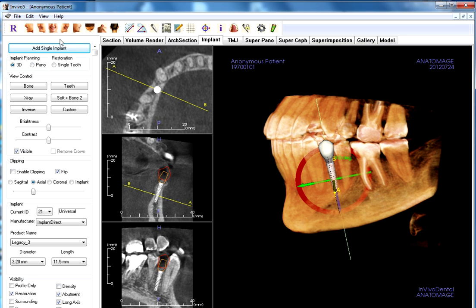That is the InVivo 5 software, and from here, along with the scan of the model, this will be sent to Anatomage, upon which they will make a surgical guide to place the implant precisely where we've mapped it out here in this software. Thank you.